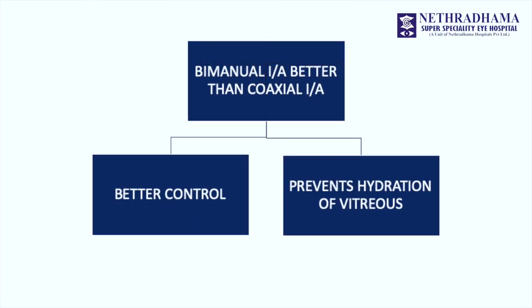The other aspect is to use a bimanual IA rather than a coaxial IA. This prevents hydration of the vitreous and you can remove the cortex in a more controlled manner. Cortical removal is always done after completing the vitrectomy and removing the vitreous. If there is vitreous in the anterior chamber, it is difficult to remove the cortex.